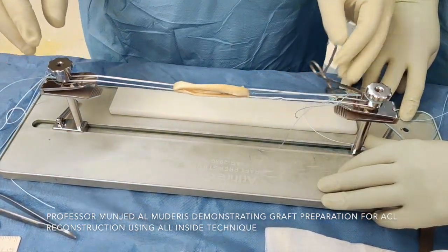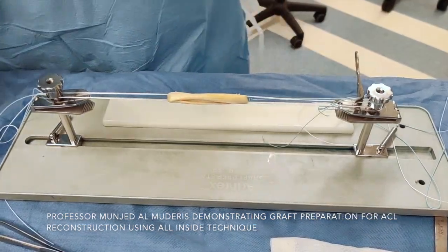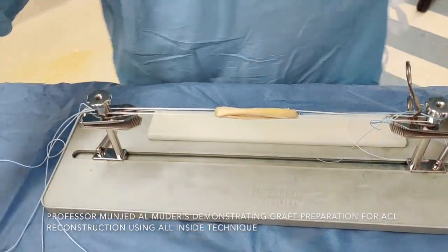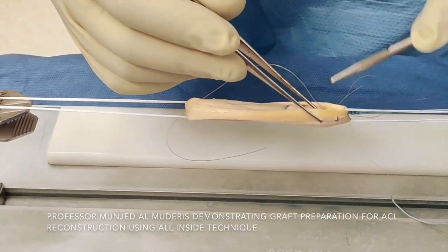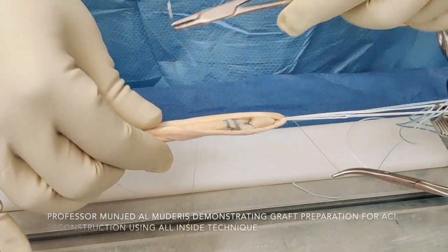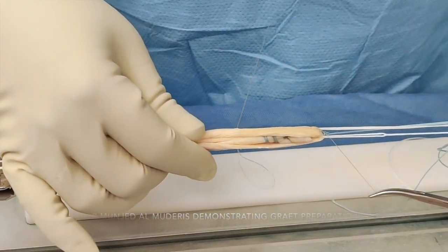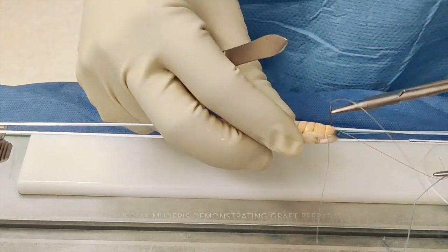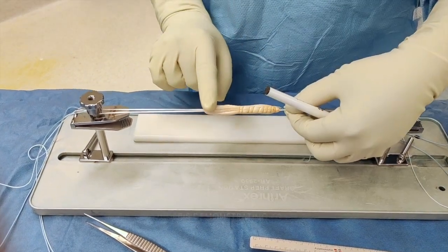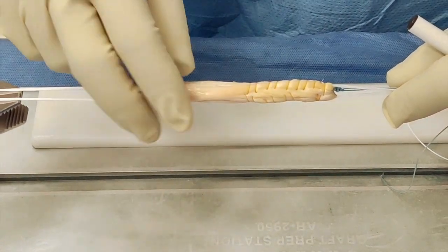I tie it to the station and then tension the overall station. You can see the graft is uniform. I then utilize a 3-0 monocryl to oversew the outer to the inner part of the tendon. You can go to the proximal part and then return back from the other side; you don't need to go all the way to the bottom. We finish the 3-0 monocryl at the same end that we started. You can see this graft preparation technique involves covering the tendon completely without any abrasive suture showing — only the monocryl is on view, and it's very smooth.